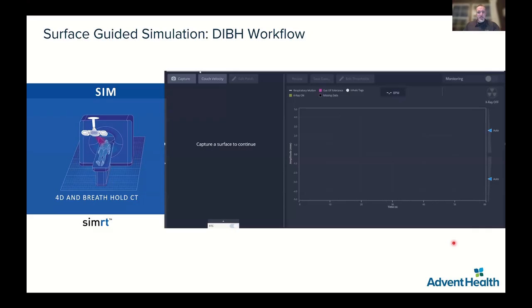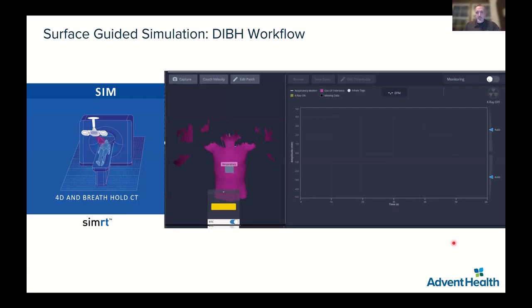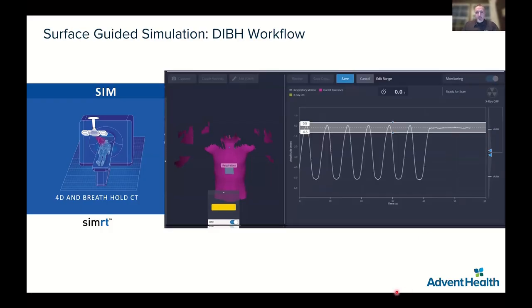What this looks like for a DIBH workflow is very simple. You take a reference image and place a respiratory tracking patch. That respiratory tracking patch acts just like you would think an RPM or RGSC block would work. You turn it on and have a set of dotted lines. This is telling you that the system is learning the breathing trace for the patient. Once that breathing trace is learned, the line goes solid, telling you it has a predictive model for breathing. Then you can easily use this in any DIBH or breath hold scenario that you like. This is a breathe and hold pattern at inspiration.